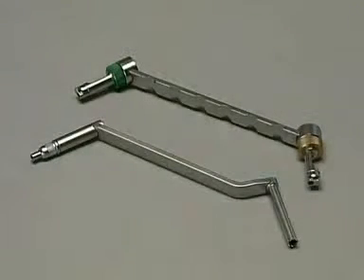A distal spiral tibial fracture. The LC-DCP drill guide can be recognized by its contoured undersurface. It consists of a green neutral end and a yellow eccentric end. The universal drill guide is a spring-loaded telescopic guide used for neutral and eccentric drilling. Both guides are used with the 3.2 millimeter drill bit.